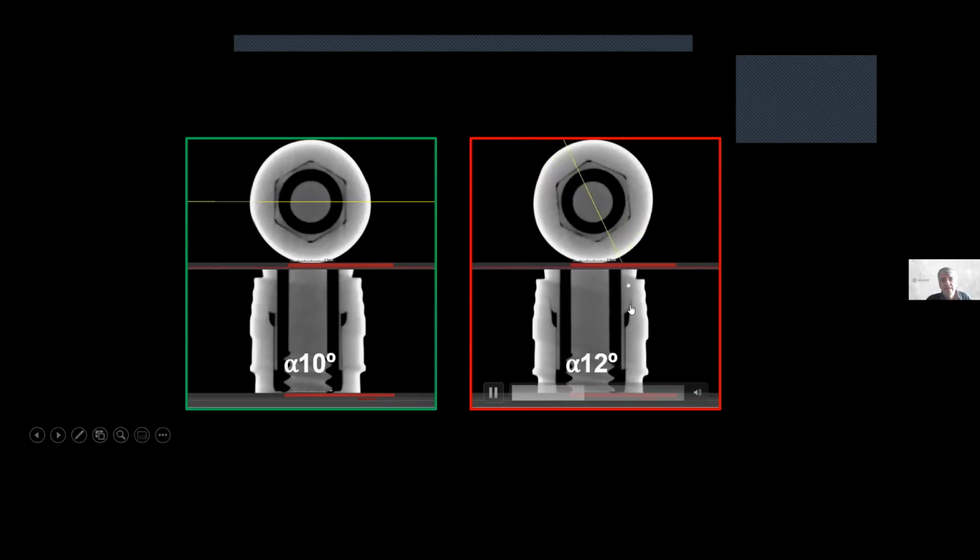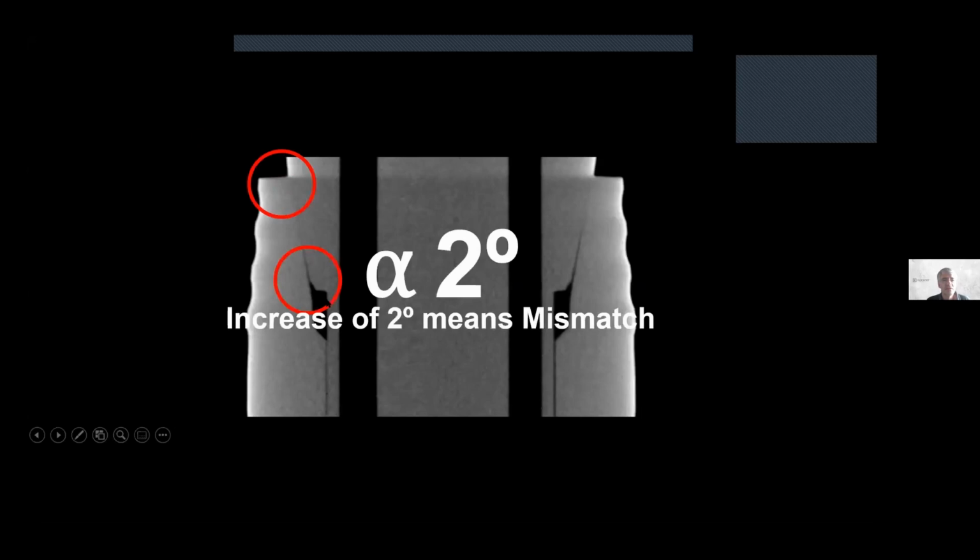The gap exists. So when you use bone level implants, it's mandatory to use even milled abutments by the company or just original components. This is the best way to avoid microfiltration. You can see it here. You get spaces where the bacteria can stay, and you may have bone loss.